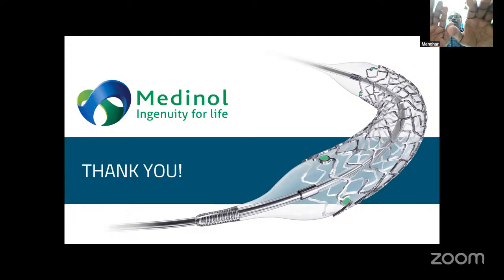One part is 42 micrometer, another part is 72 micrometer. So the flexibility is more. Whenever you are placed in these bifurcation areas, the cell will be opened easily. That is the advantage of this type of stent.